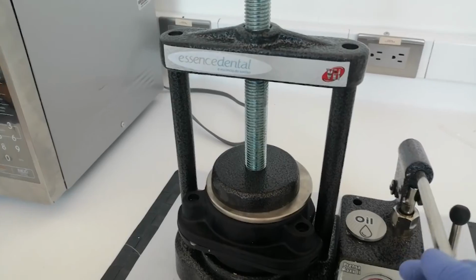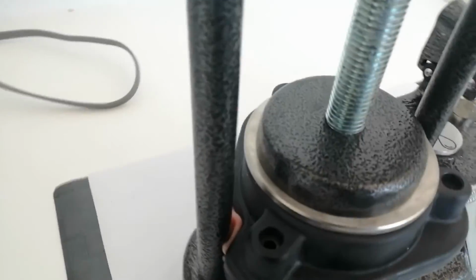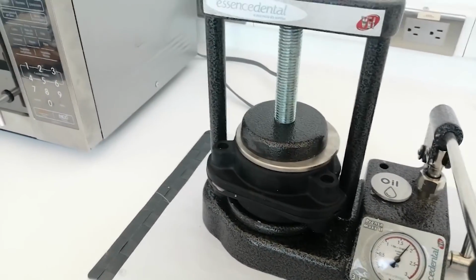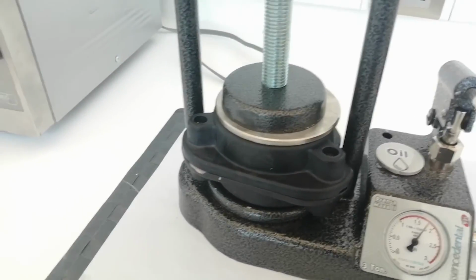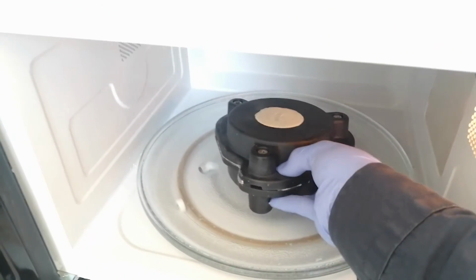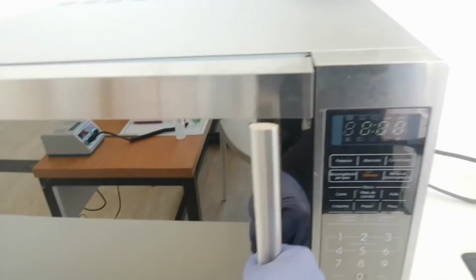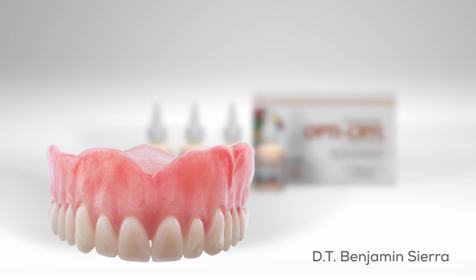Close the flask and apply a thin polyethylene sheet with the amount of necessary pressure, 1200 to 1500 psi, for trial packing to remove excess acrylic resin. Apply this technique at least a second time to ensure you have a better vertical dimension of the prosthesis. The curing can be accomplished by way of traditional curing in a hot water bath for 2 hours or in a microwave using the new Stetic microwave flask. This technique requires only 4 minutes of curing time. Conventional finishing and polishing processes are employed.